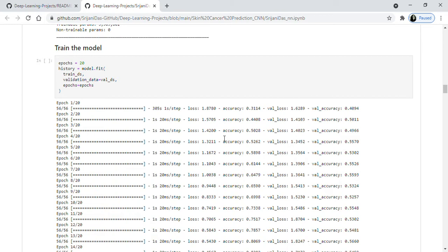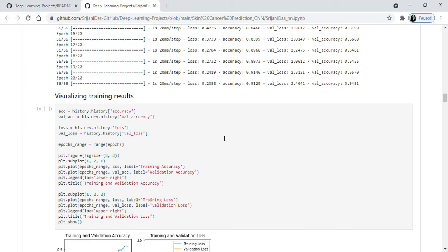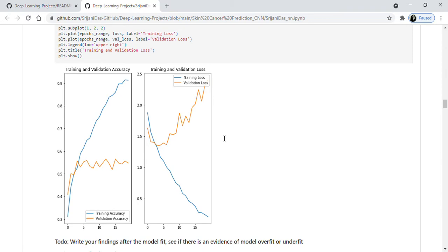I ran this entirely on Google Colab, so you can understand my situation. Next, we are checking out the training results. The blue line is training accuracy and the orange line is validation accuracy. As you can see, training accuracy has improved a lot, but validation accuracy, which is what we should be more concerned about, hasn't improved much beyond 0.55. So the model is overfitting and not able to generalize well. Similarly, the training loss is reducing monotonically, but the validation loss has started to increase after a point, which is not a good sign.